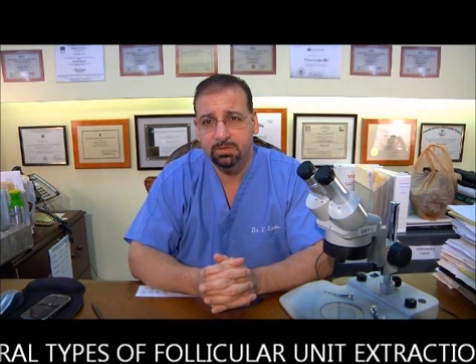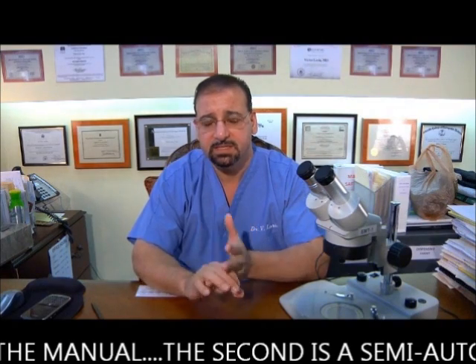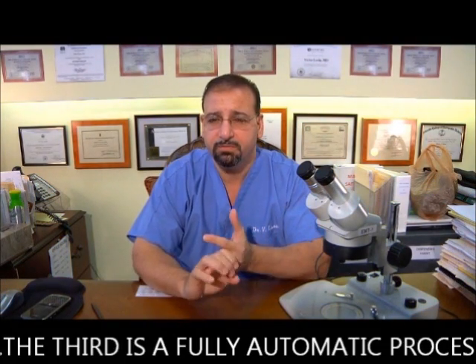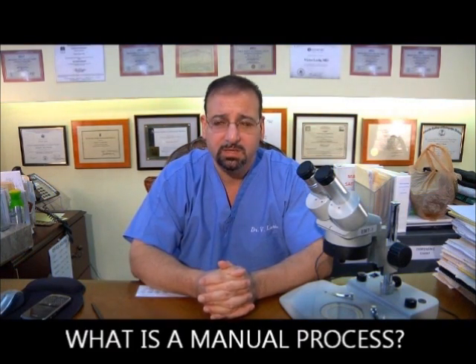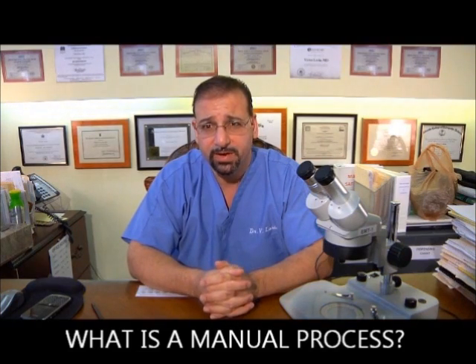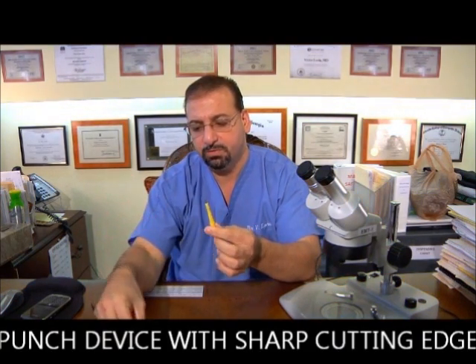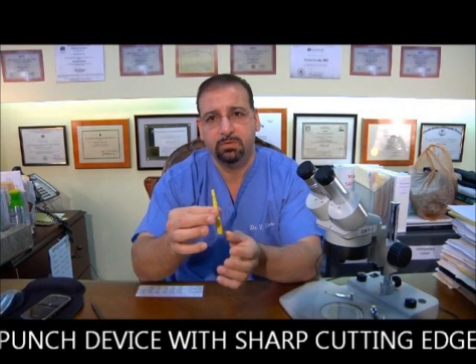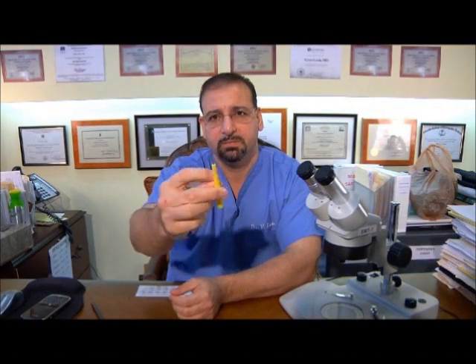We have three general types of follicular unit extraction methods: the first is manual, the second is semi-automatic, and the third is a fully automatic process. In a manual process, you take an instrument — called a punch device — which has a sharp tubular cutting edge. This is held by the surgeon's hand, and in the back of the scalp he'll cut in and twist, rotating the punch to extract follicular units.